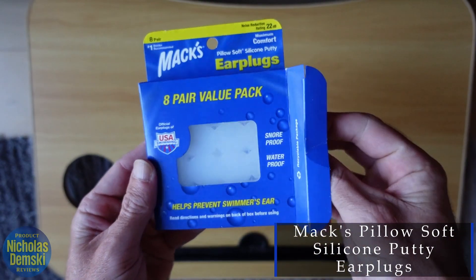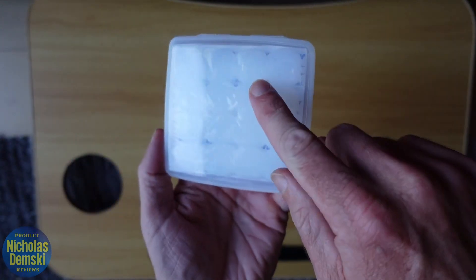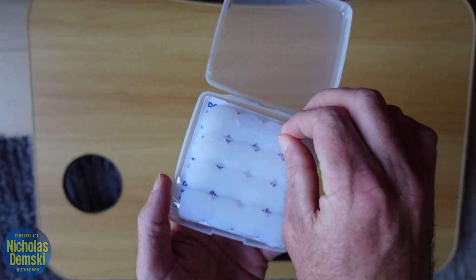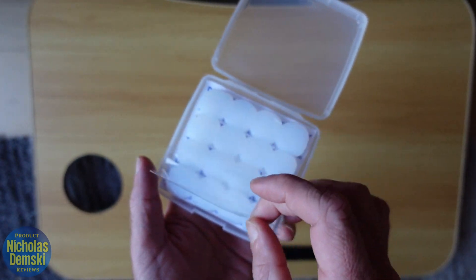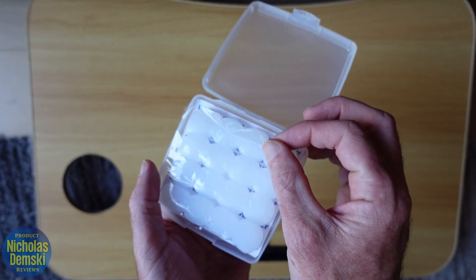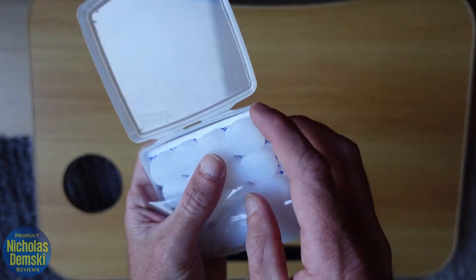I want to show you these Max Pillow Soft earplugs as they come out of the box. I've actually been using earplugs like this for 12 years. They come in this box right here that folds back, and there's a piece of film plastic over top of them that you can peel back to keep them safe and clean, then put back over top when you're done. Let me show you exactly how to take these out and use them.